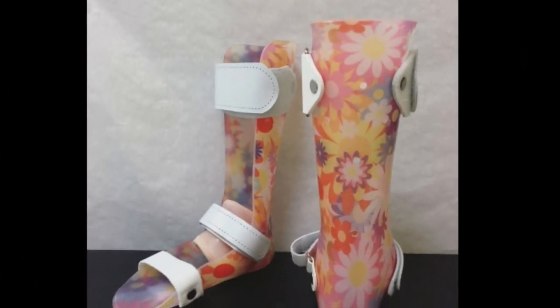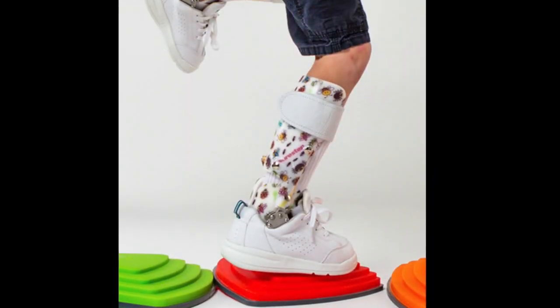Our patient in this video is a long-time patient who wears something called an AFO, or ankle foot orthosis. An AFO is for people who have what we call foot drop, and it's a brace meant to go inside an athletic shoe. This patient uses the brace as her shoe, which is fine except it shortens the life of the device, and the device has not been adjusted enough to take the pressure off one spot on her foot, which has created this very thick, painful callus. This is one of the toughest calluses tried to remove, with blades basically bouncing off the callus. Because she let it go so long, it has turned into an open sore underneath — and this is the danger with letting calluses go too long.